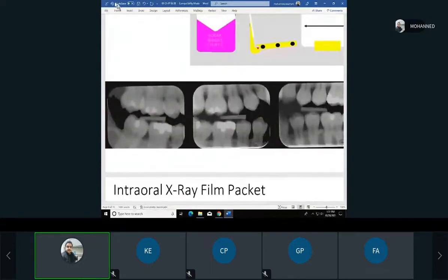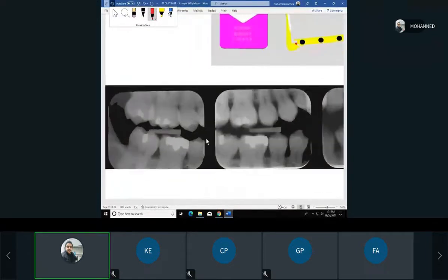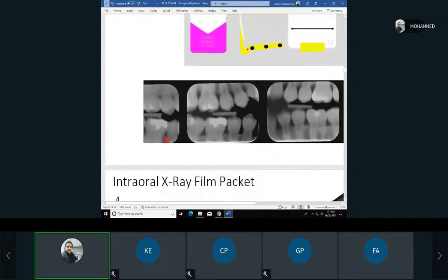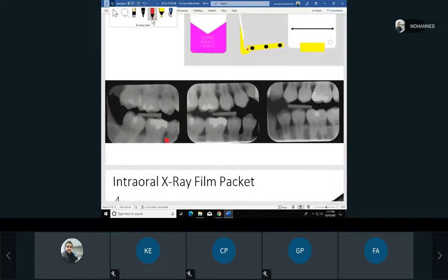An important part of that happens especially with the bitewings. So if we have a bitewing here, do you see where the dot is on your computer? I'm not sure, is it on the left here? So we have a dot here. And we agreed in the office that anytime we take an x-ray, we will place the dots on the mandible.